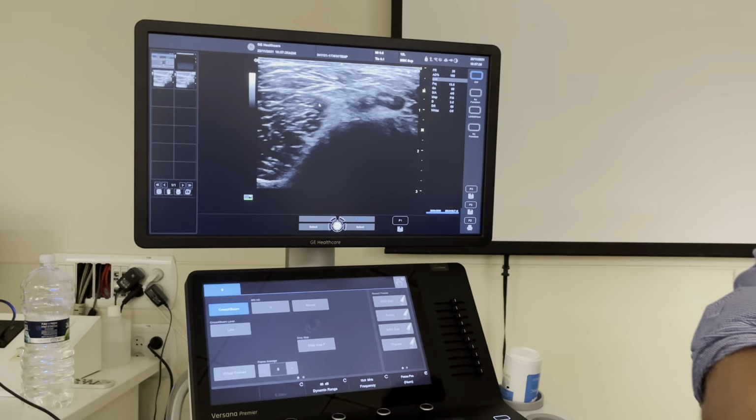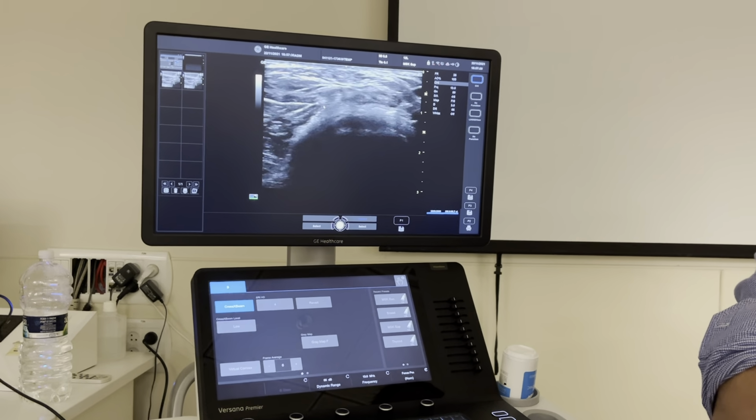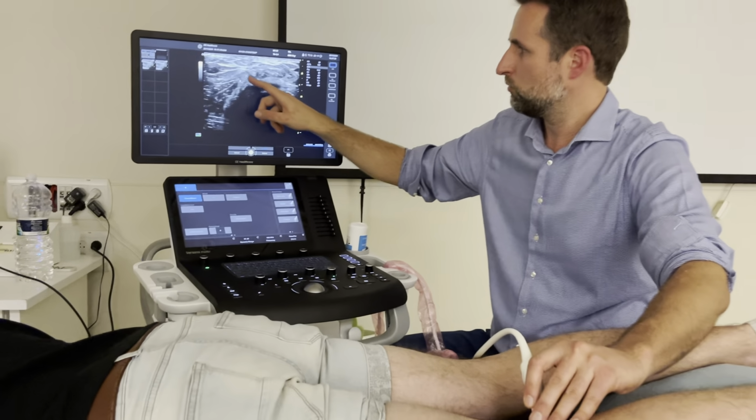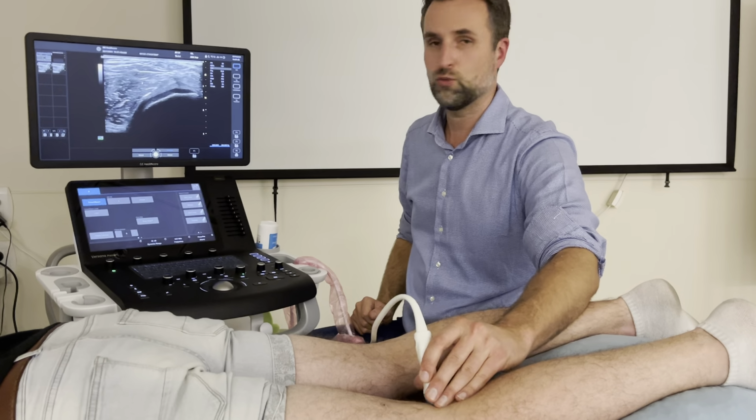And I call this sometimes the yin-yang, because now this is yin and that's yang, or the other way around, and I do this, and then it's the other way around. Yeah, this one becomes black, this one stays white, and you can yin-yang in between, and then you know that between these two tendons, that's where the Baker's cyst will arise.